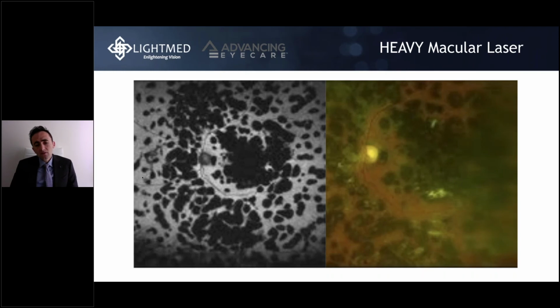So from my slide, the 10 to 15%, this is something that I found in the literature, but myself, I like to use 5% to 7.5%, because for me, when you're treating the macula, probably less is more. If I feel like in the first session of the treatment I didn't get the full response that I was looking for, I can definitely add another treatment session. It's always better to do it in a safe way, because you want to preserve the patient's central vision. The slide that we have here, I don't want to see it, and it should not happen in our lifetime nowadays. So I found it safe to do 5 to 7.5%.